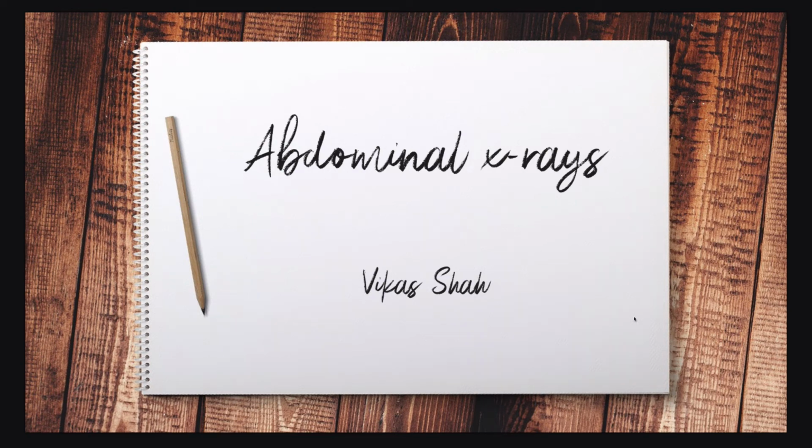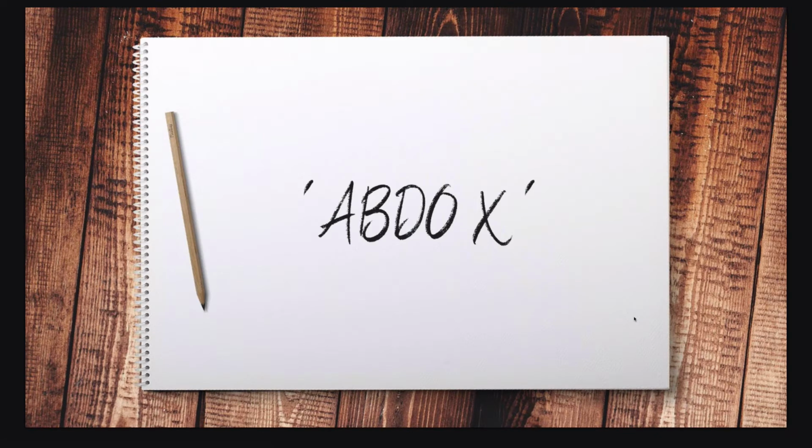Okay, so let's start talking about abdominal x-rays. Now, I'm going to introduce my system to you for how to analyze abdominal x-rays. There'll be similar systems you'll have come across for chest x-rays, which may be based on compartment or anatomical structure, such as working from out in or working from the center outwards. Or it may be a letter-based system, such as the ABCD approach.